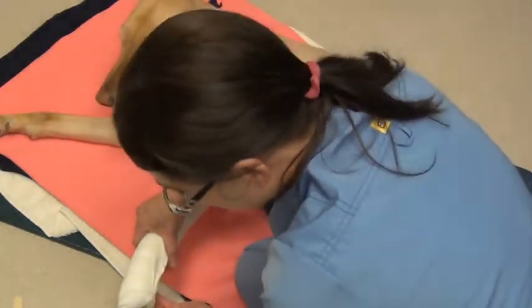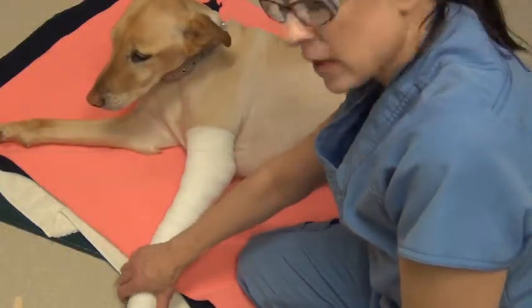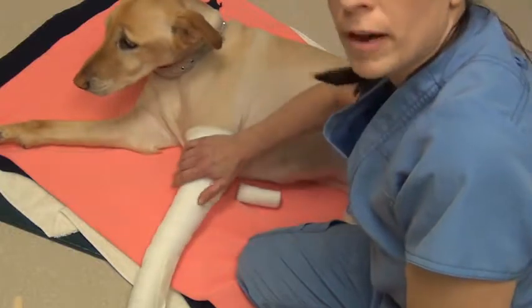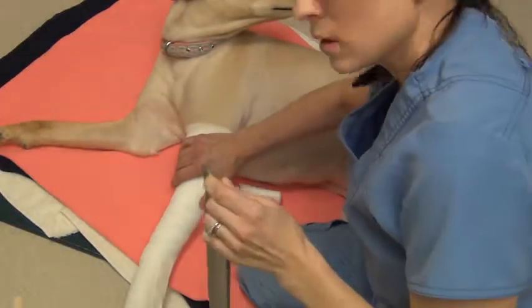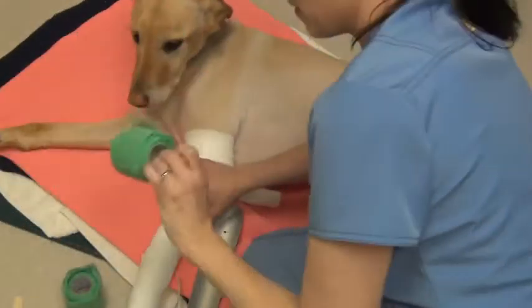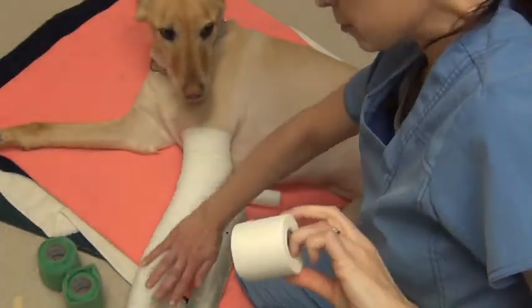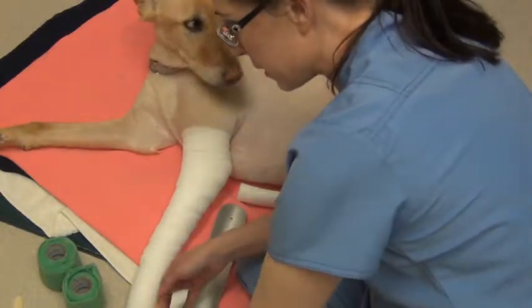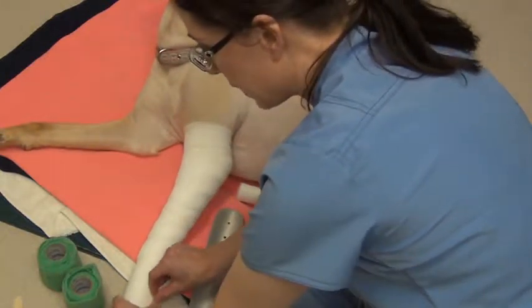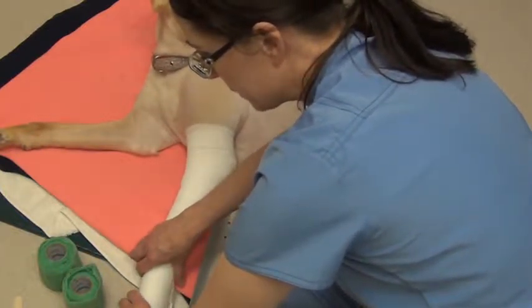Alright. And here's the part where if we wanted to, we could place this bandage without placing a splint. I would just cover it with vet wrap. But since we learned how to do it with the splint in our video, we're going to show you with the splint. So I'm going to get my splint ready. I'm going to get my vet wrap ready. And I've already pre-unrolled that so it's not tight. And I've got some waterproof tape to place on the end for the spot of the foot that's going to actually come down and strike the ground. We want to keep that from wearing out and wearing down the tip of the splint.